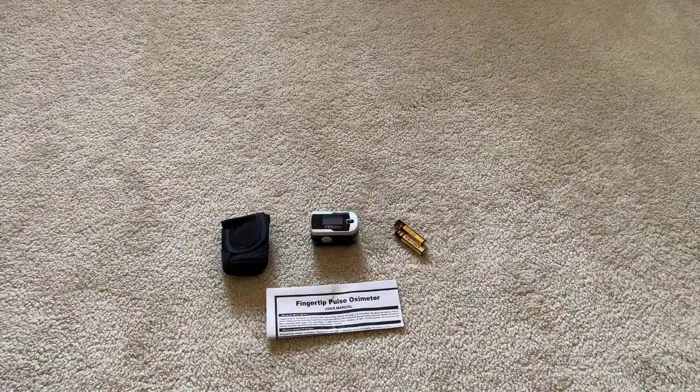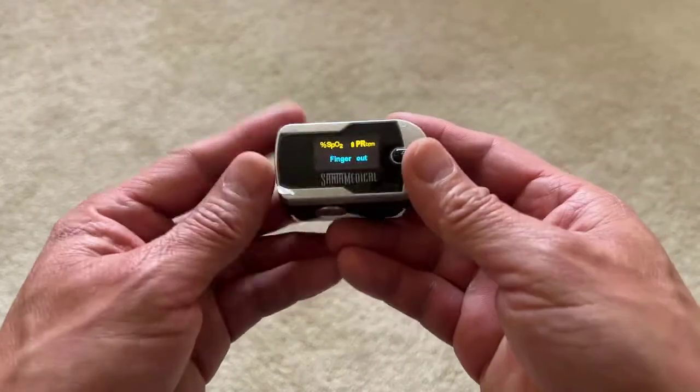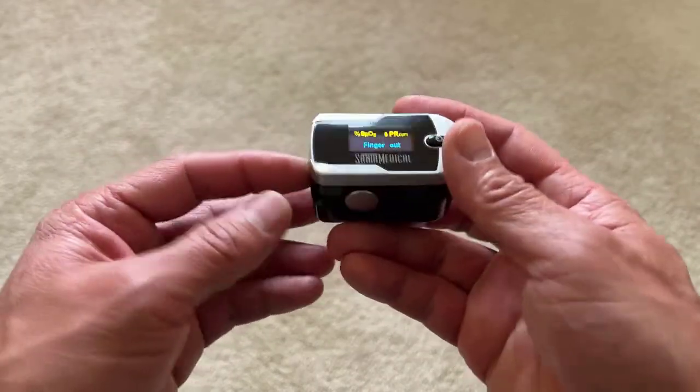Let's put the batteries in and see what we get. You can see that it has a nice bright LED screen and it will auto power off after 10 seconds of non-use.